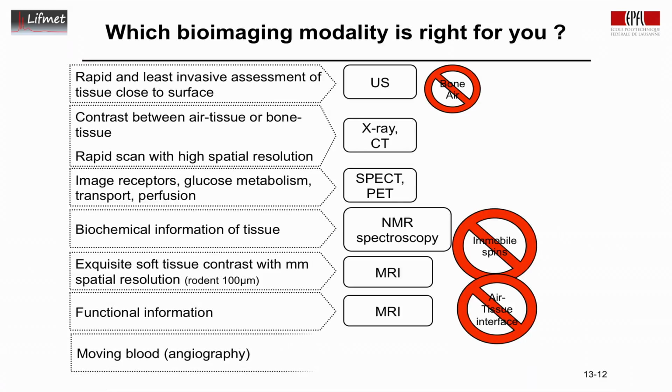And finally, if one wants to image moving blood, that's angiography, we actually have a number of techniques available.